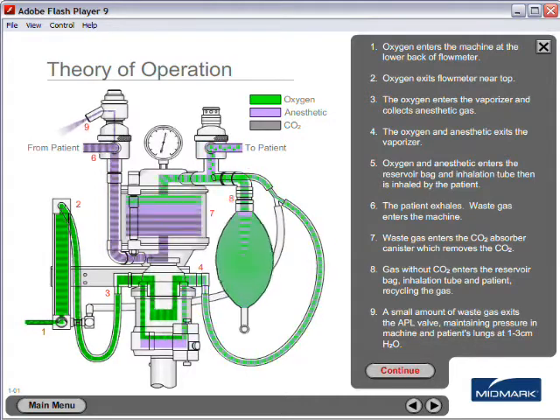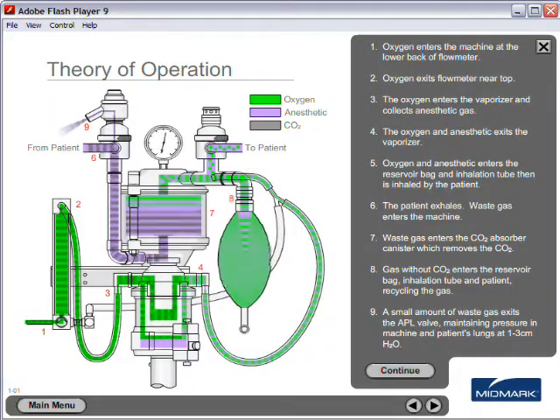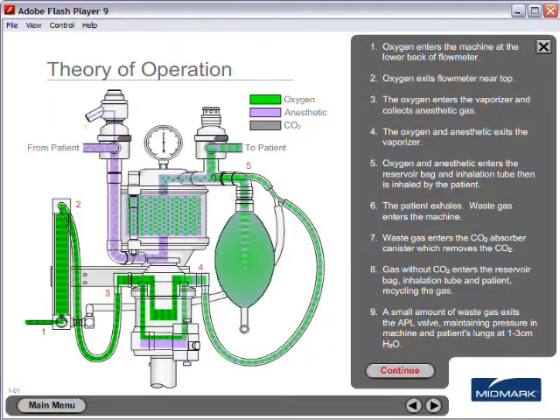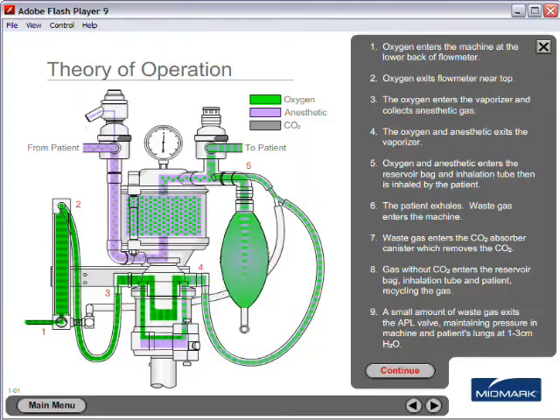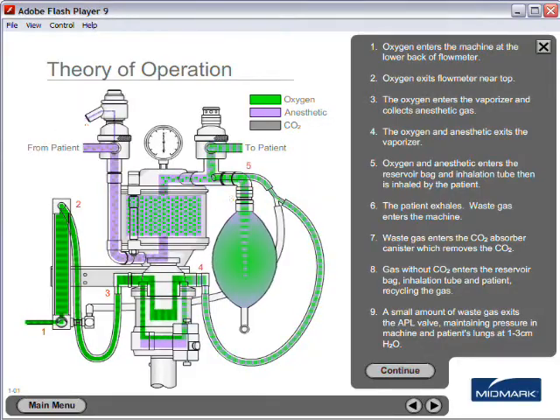A small amount of waste gas exits the APL valve, maintaining pressure in the machine and patient's lungs at 1-3 cm H2O.